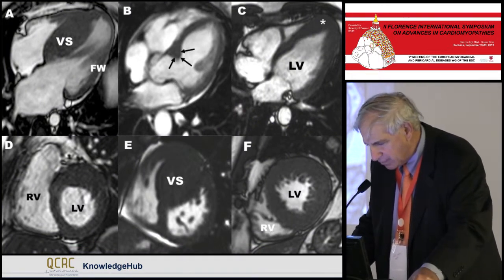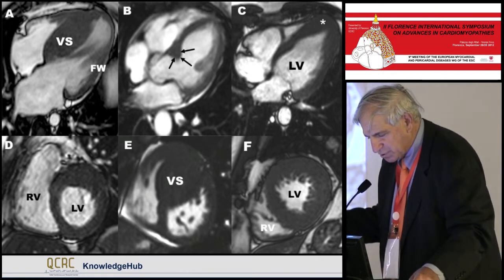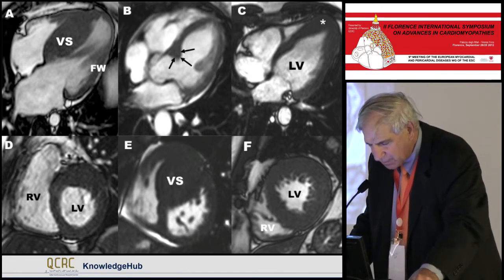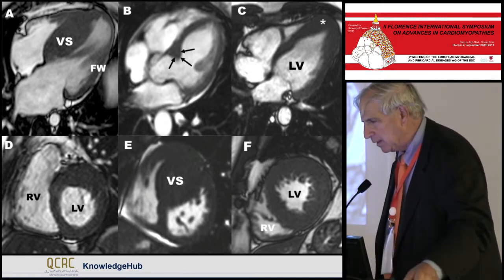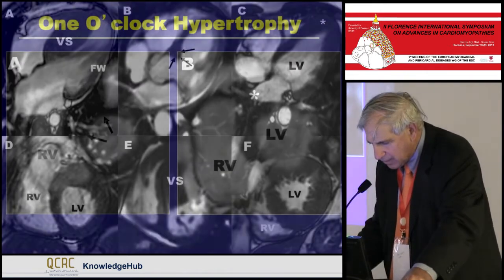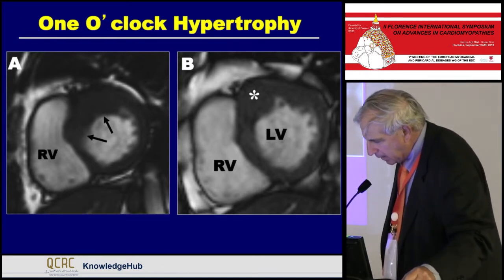They are pretty pictures, and in hypertrophic cardiomyopathy we can see the distribution of hypertrophy and make more precise measurements than was ever possible with echocardiography, reliable and reproducible. But it's not really just an issue of pretty pictures, and that's where I'm coming from today.